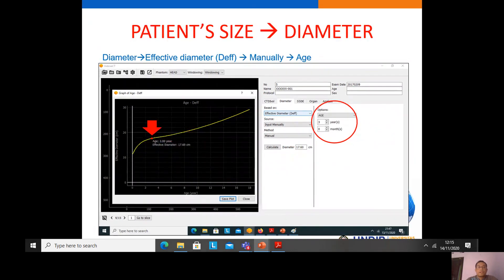Another example: if we only have the age of the patient, we can also get the effective diameter using the patient's age. We input the age — for example, 3 years — and calculate the effective diameter. We get the effective diameter for a 3-year-old patient, and we also have a curve showing the effective diameter at the age of 3 years.